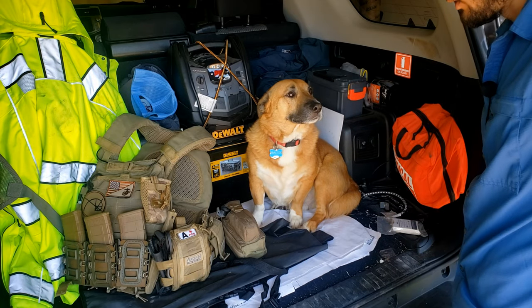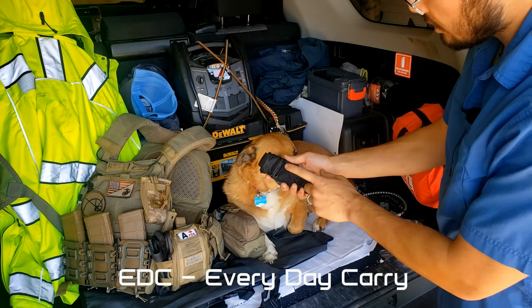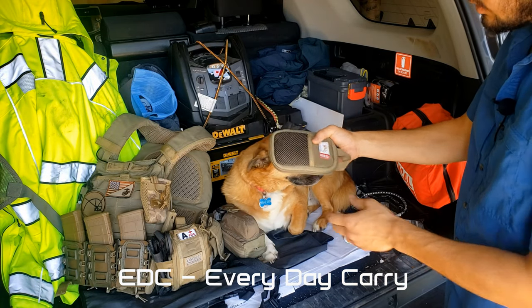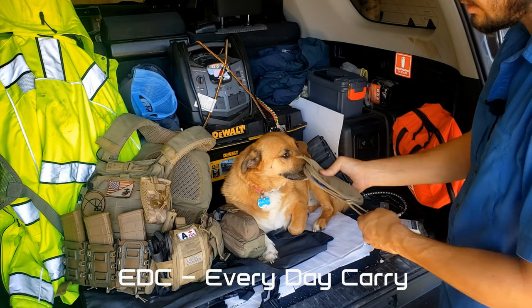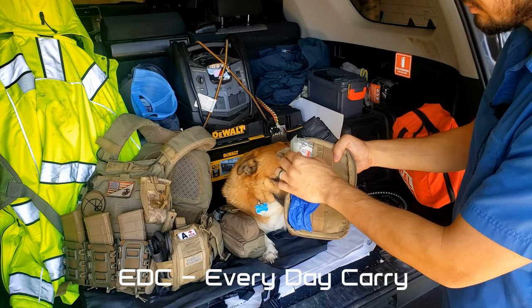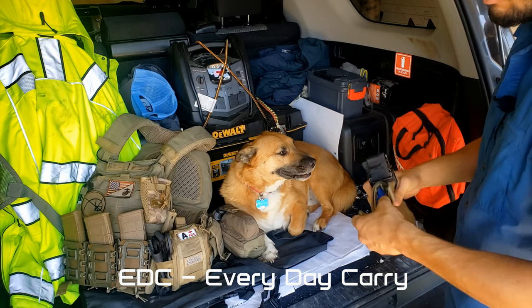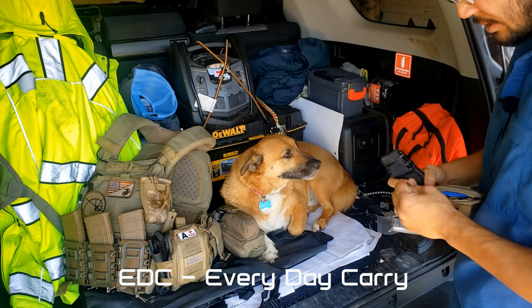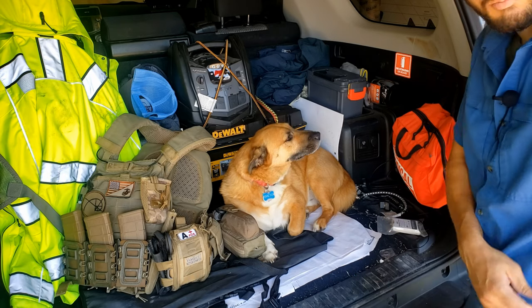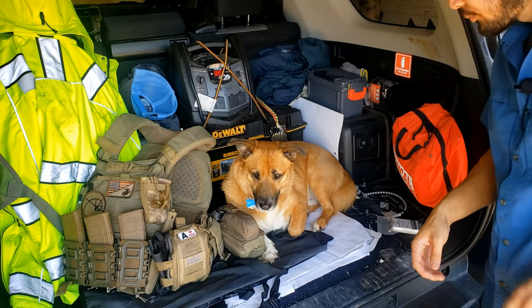So we're going to start off with the smallest system, and it's actually what I carry on my person. I carry a SOFT-T Wide tourniquet. I carry this Wild Hedgehog tactical kit with a lot of the components removed: nitrile gloves, hemostatic gauze, Steri-Strips, and some basic first aid band-aids. This is on me at all times, unless I'm working out. I have these in my pockets. I wear 5.11 Ridgeline style pants, so it's got that third pocket between the front and the rear pocket. So that really helps out.